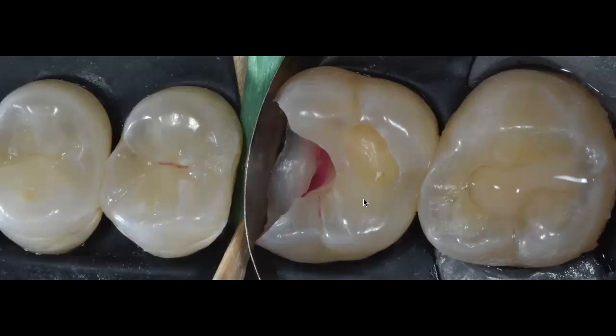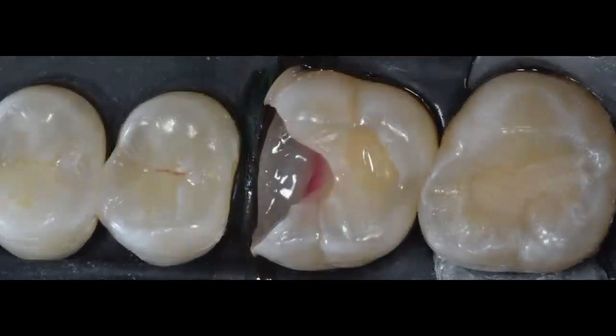You can see that this is a deep margin. So I'm trying to adapt that band as best as possible to that gingival floor. Once I accomplish that, I'm gonna use my 2-bottle adhesive system, primer and bonding, and then I'm gonna light cure that prime and bond. I'm gonna resin coat that prime and bond, and then I'm gonna go ahead and elevate my deep margin as you are seeing in this photo.